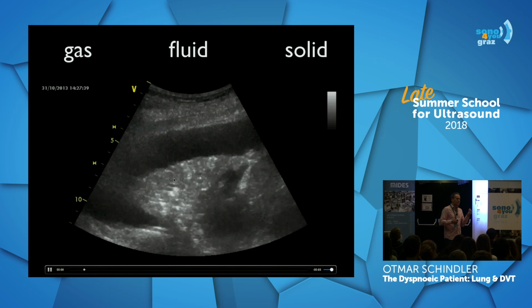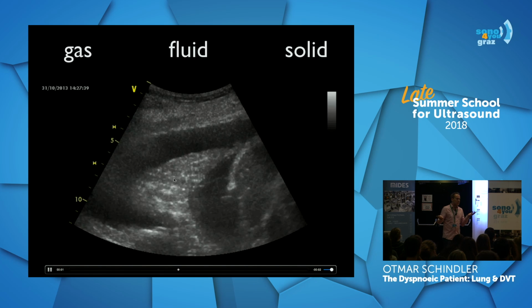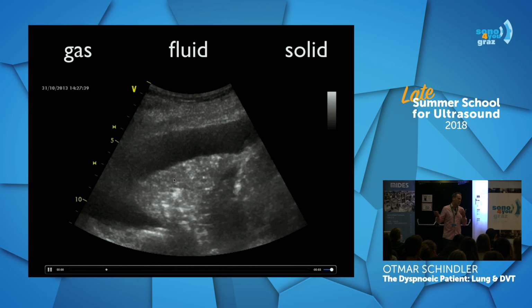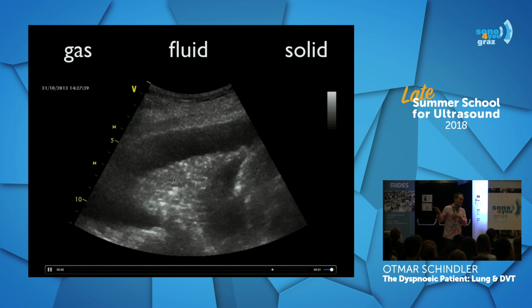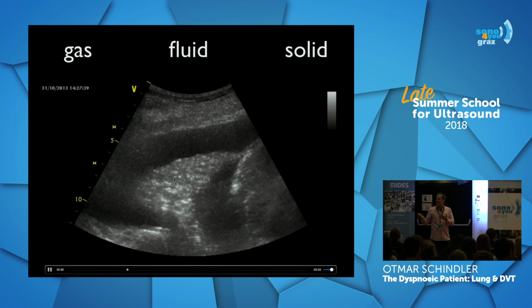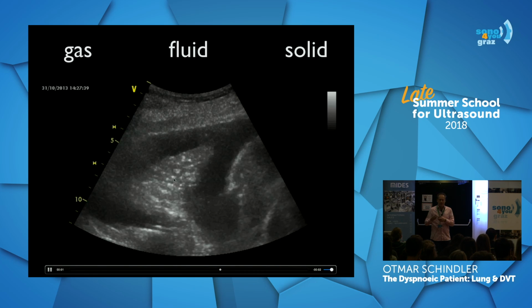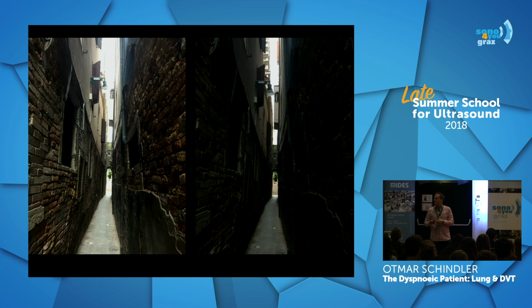What's that? Gas. So which gas usually? Air. That's all. It could also be gas in an abscess, for example. But in this picture, it's just air. Why is there air inside? That's the bronchi. That's bronchogram. Okay. We are working mainly with artifacts, we say. We don't see the lung, we just see the artifact, so we see if it's pathologic.